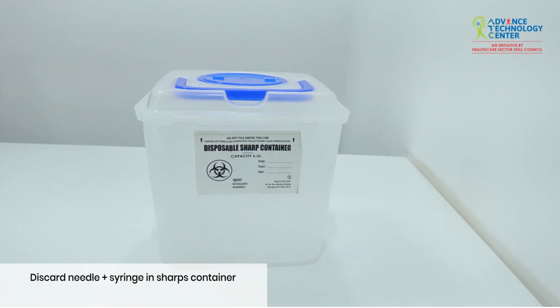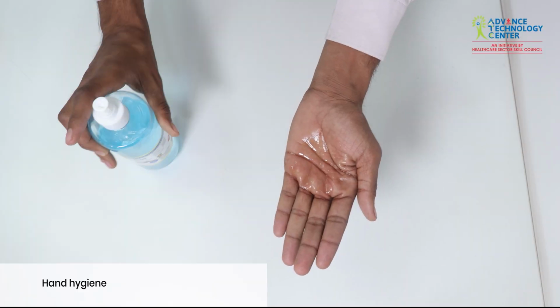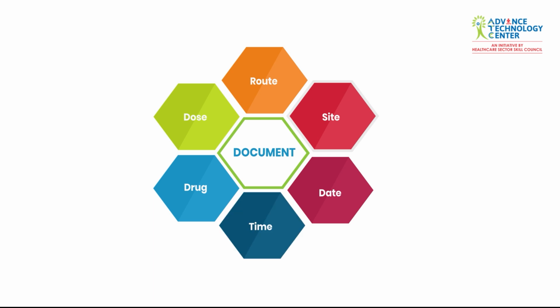Post-procedure actions. Immediately discard the syringe and needle in a designated sharps container. Remove gloves and perform hand hygiene again. Document the procedure in the patient's chart, mentioning the drug, dose, route, site, date, and time.